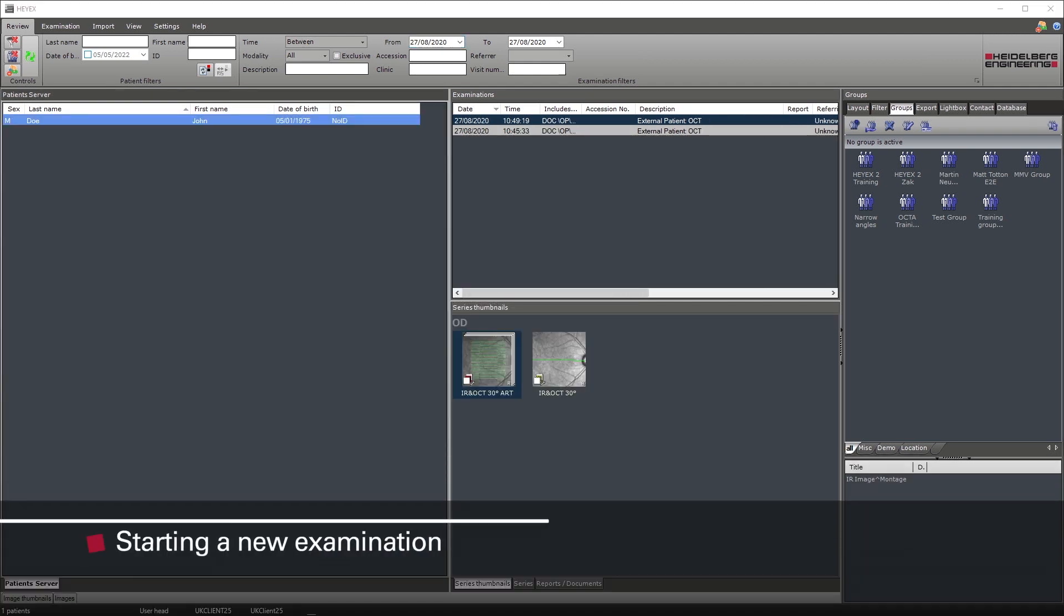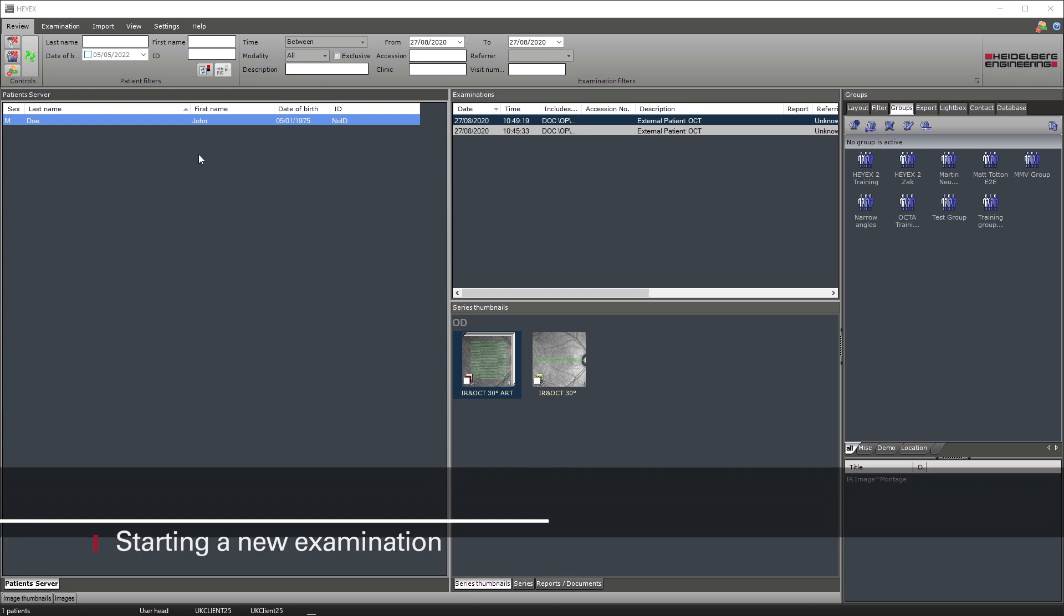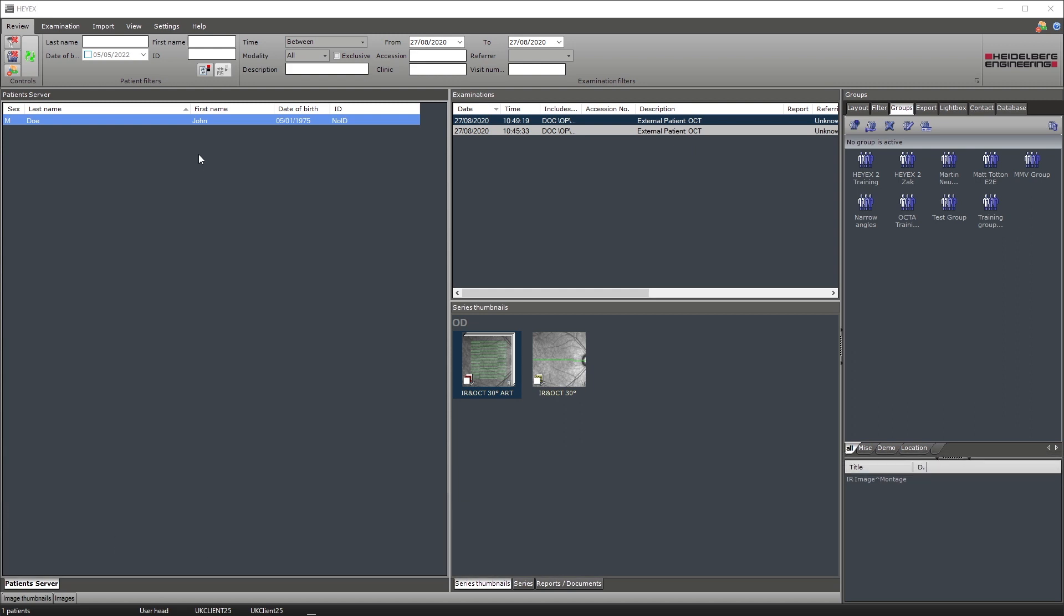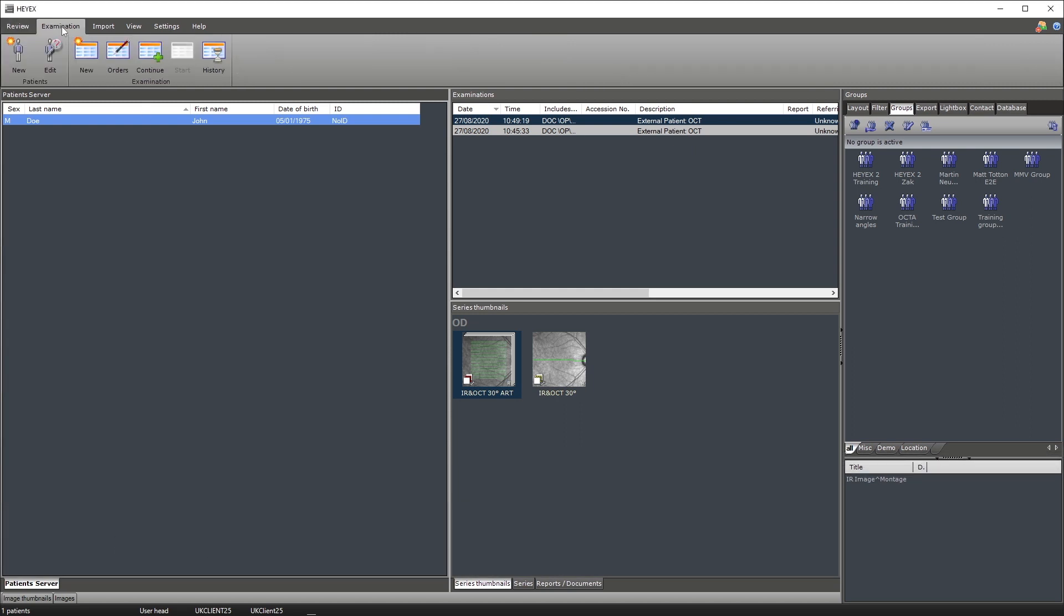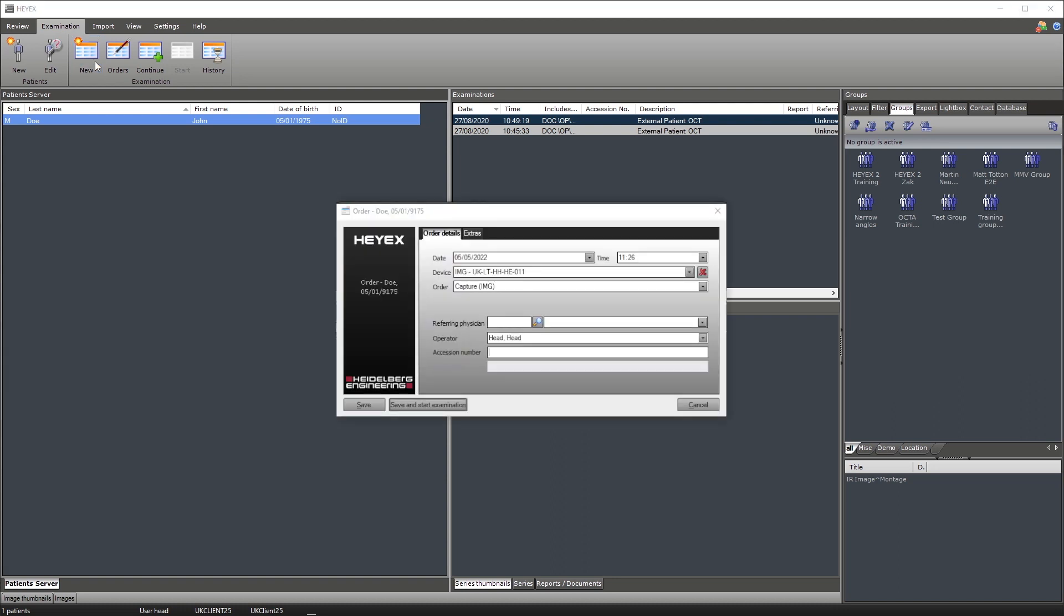Once you have searched for the existing patient, select the examination tab on the ribbon bar. The third icon running from left to right on the examination tab says new. This icon means new examination. To start a new examination, click on the icon. You'll be then presented with a new order. Once you click save and start examination, it will take you through to the image capture window.